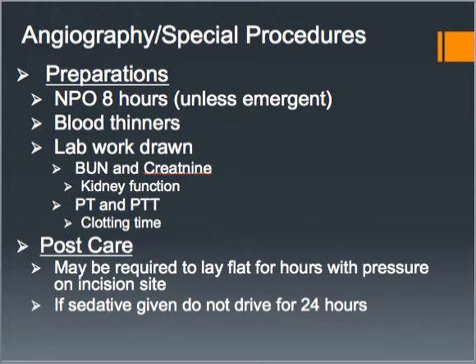Diabetics, if the patient's diabetic and taking glucophage or metformin for treatment, they need to stop taking that for at least 24 to 48 hours prior to and after the exam, because that interacts with the contrast and it can actually cause kidney failure.